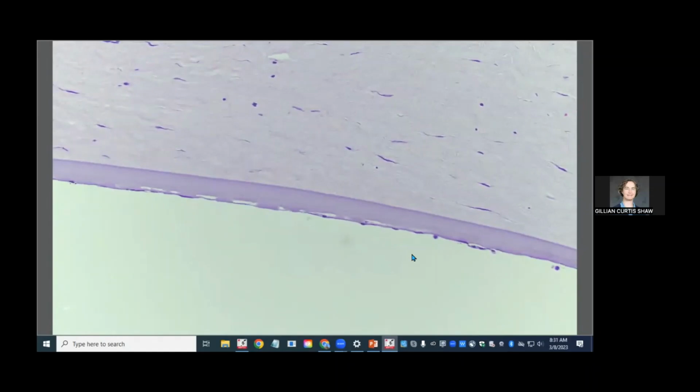And indeed, the history that I withheld from you is that this ringtail cat was already diagnosed clinically with corneal endothelial dystrophy and had been dealing with corneal edema probably for much of this cat's life, but not the reason why the cat died. Just a really cool case and neat histologic correlates.